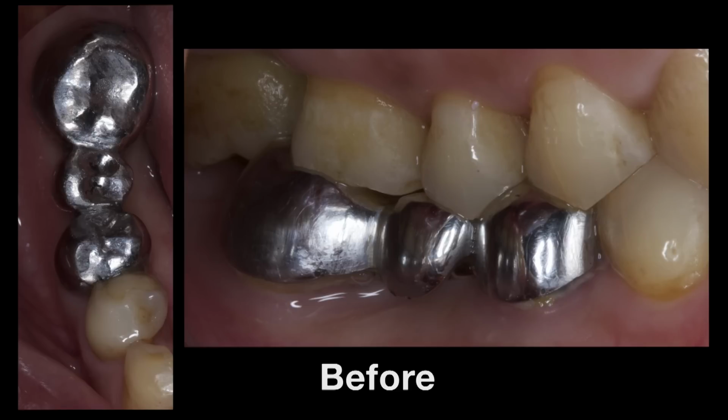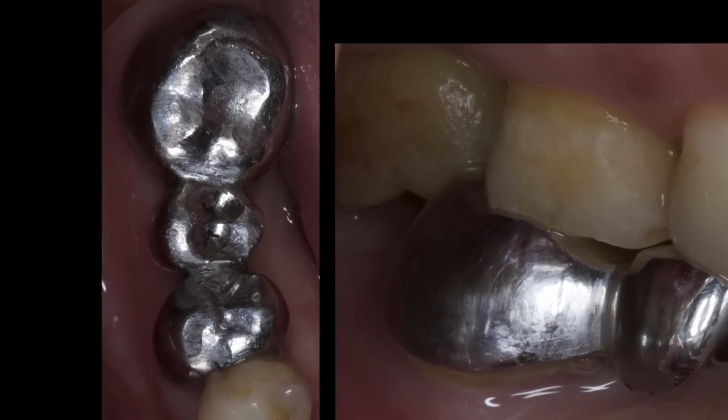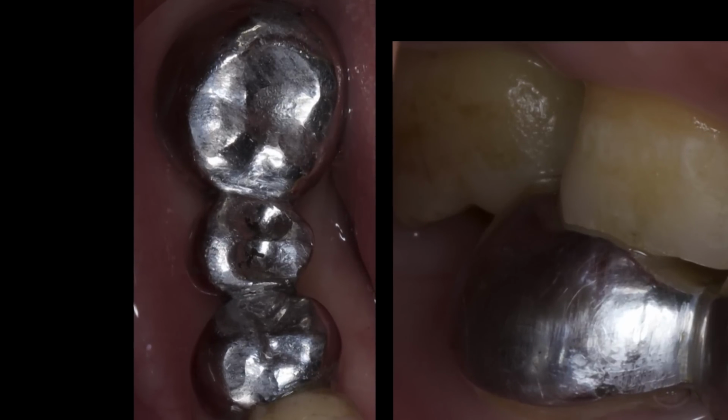This 50-year-old male patient presented with a 3-unit metal bridge that had open margins, resulting in significant secondary caries. Due to the patient's delay in restoring the edentulous area, we can see the mesial inclination of 31 and how a premolar-shaped Pontic took the place of number 30.